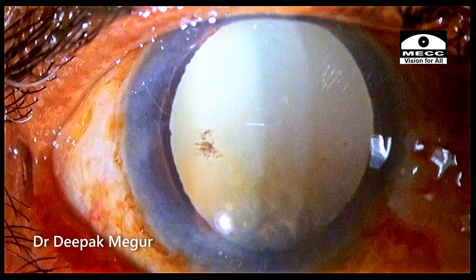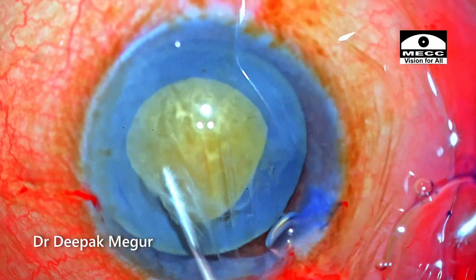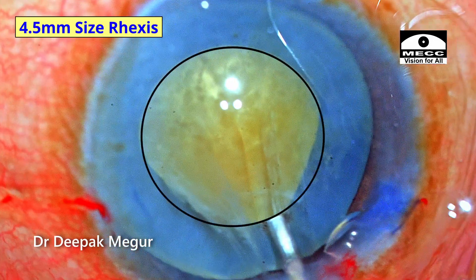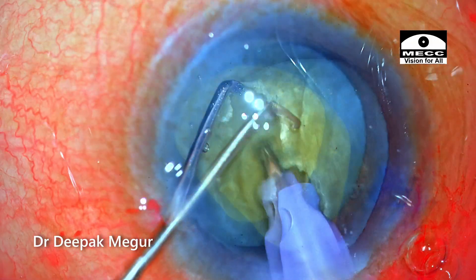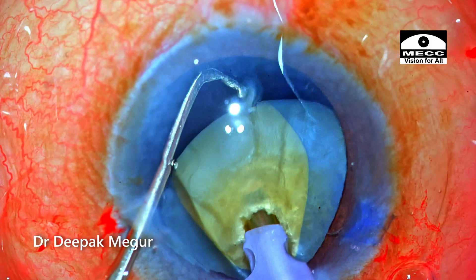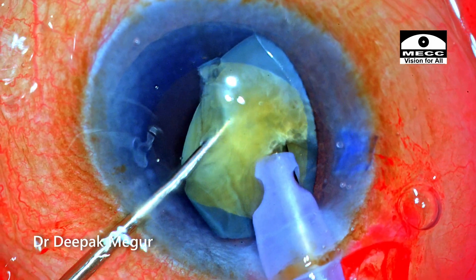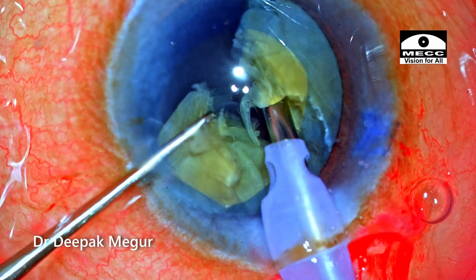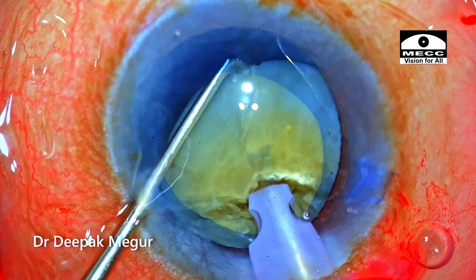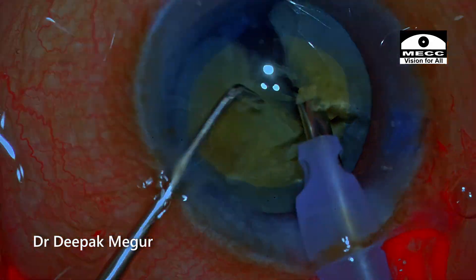Let's rewind and learn a few things. When managing a Morgagnian cataract with an empty bag and a relatively small rhexis, it's important not to overdo things. I'm using horizontal chop because the physics of horizontal chop ensures no stress is imparted on the zonules — the two instruments move towards each other rather than towards the posterior capsule or bag.